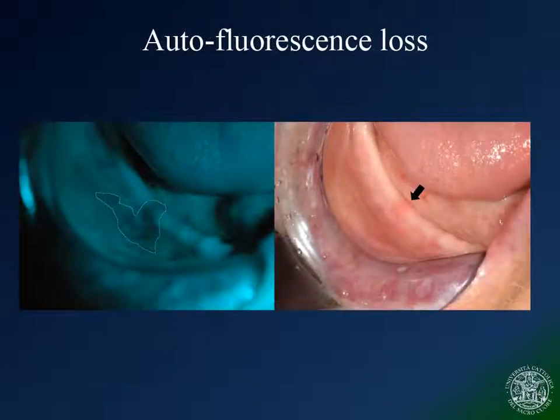Here you can see an oral cancer in an edentulous patient in follow-up after surgical resection of a malignant lesion. The lesion is barely visible if the oral examination is performed with superficiality. Loss of fluorescence increased contrast, making it easier to see the tumor. Also visible is a clear difference in the extension of the margins of the lesion. Fluorescence loss extended beyond the margins which were visible to the naked eye.